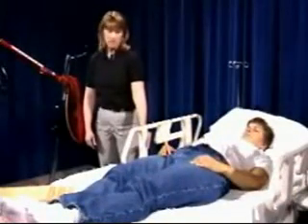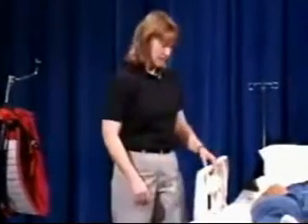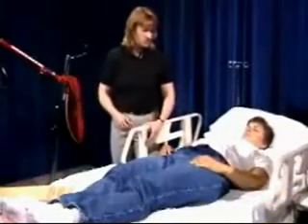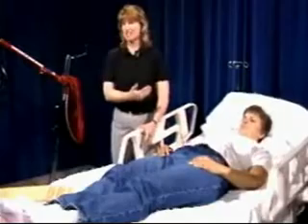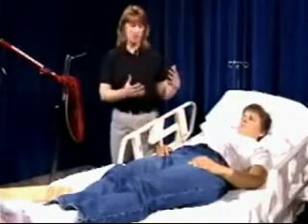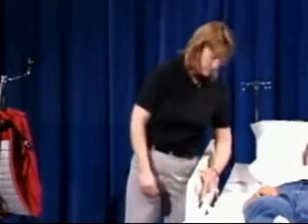The bed can also be used to assist you if you're trying to get the patient up into a sitting position. You can raise the head of the bed, and that way the patient is in more of a sitting position to get you started. Please don't do that if we're working with this patient on the functional goal of getting from laying down to sitting up, and hopefully if we are, we've made you aware of that. But if that's not a goal of the patient's and it just makes it easier for you, please use the settings on the bed to assist with that.